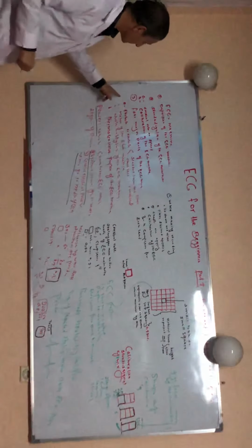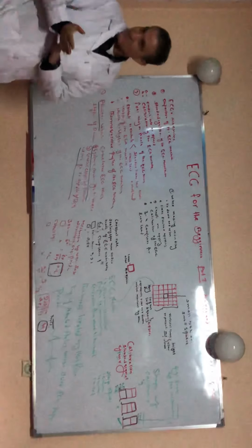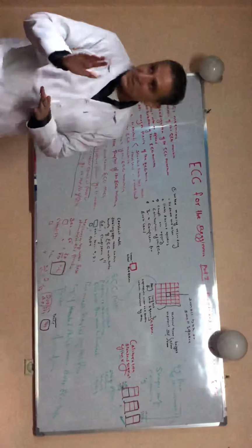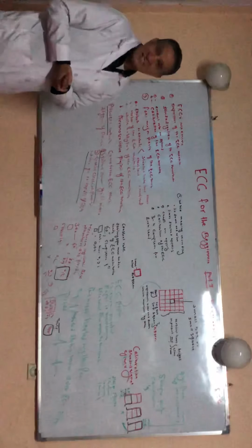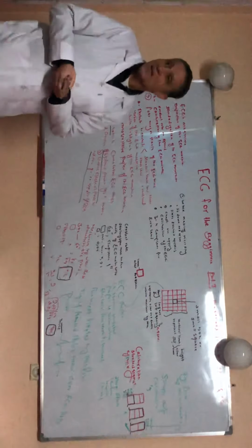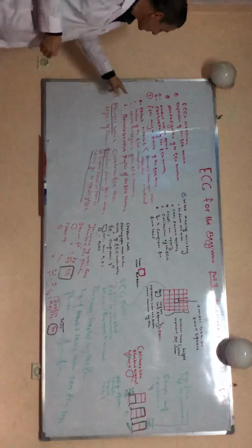First the electrode, the second the motor. The motor moves the ECG paper under the needle of the ECG machine, and the heated stylus moves over the thermosensitive ECG paper and produces a trace. This is the mechanism of the motor.